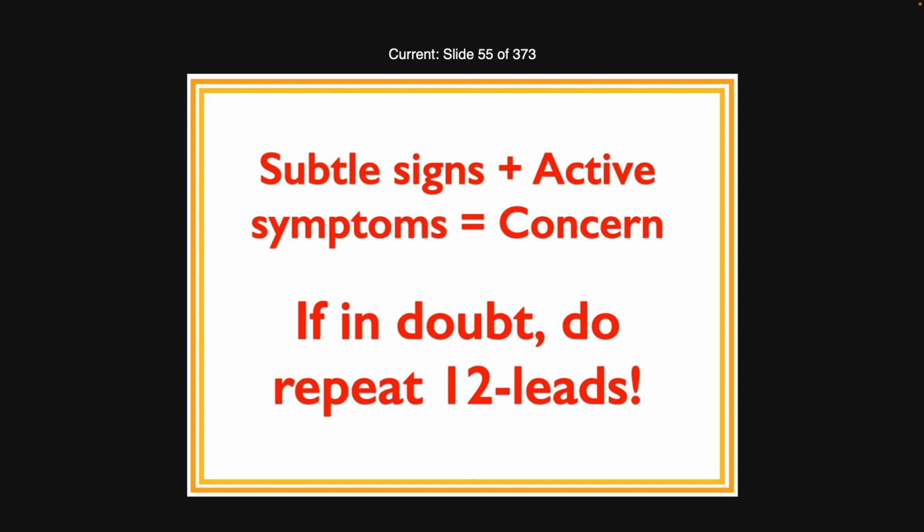Everybody knows the difference between concave upwards and convex. You ready in the back row there? Sorry. So when we say concave upwards, that's what we mean. Typically, remember that's as compared to straight or convex upwards, like the tombstone T waves, okay? Typically, and if you remember what Dr.